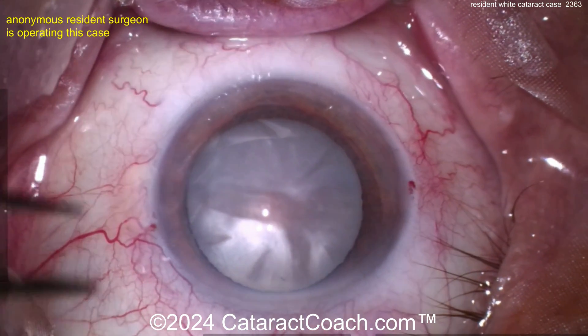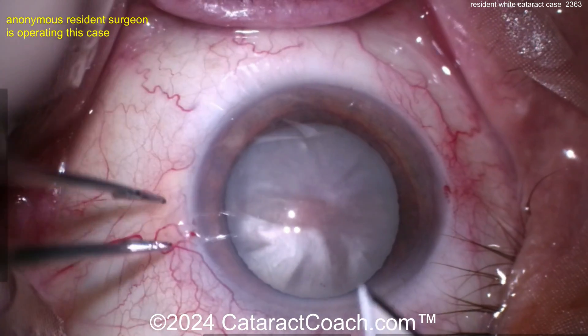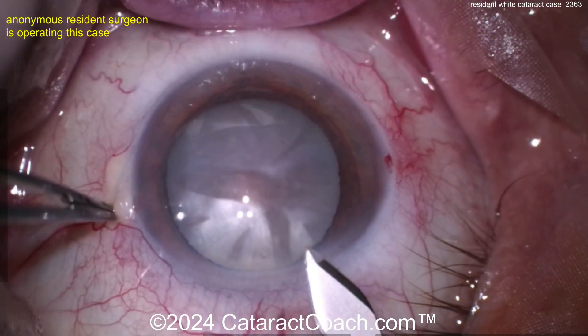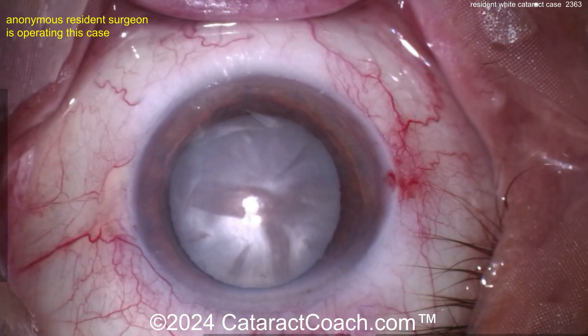Why are there eyelashes on the surgical field? I won't belabor the point but you understand what I'm saying. Now here's the main incision — you've got a pretty white cataract there. That looks pretty good, certainly sitting superiorly.